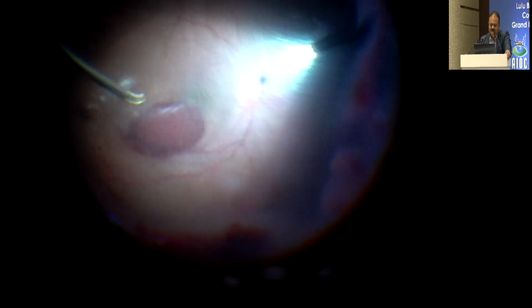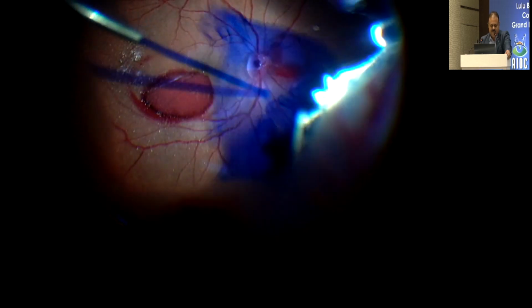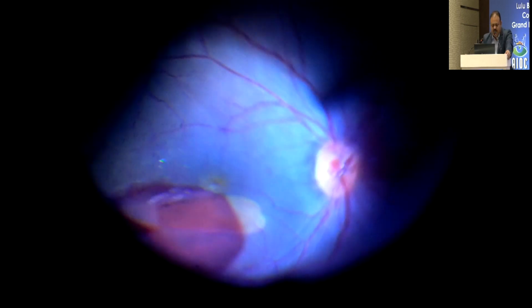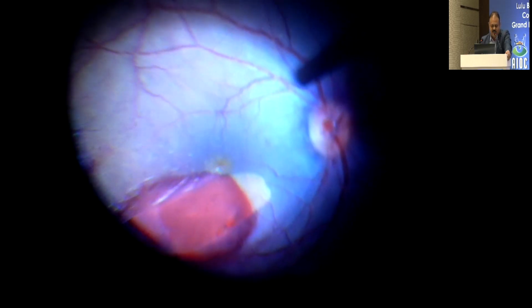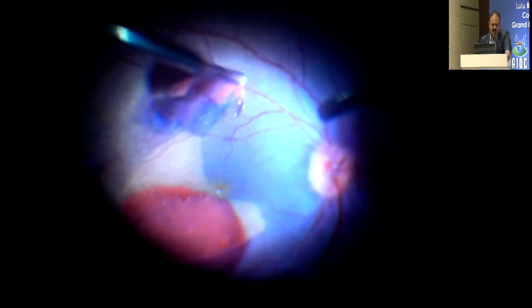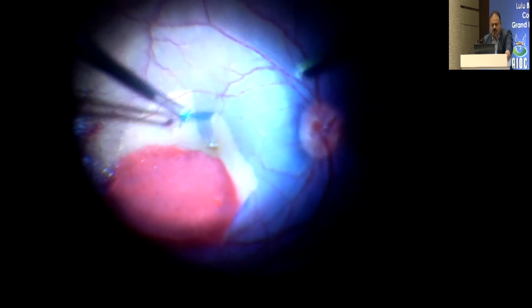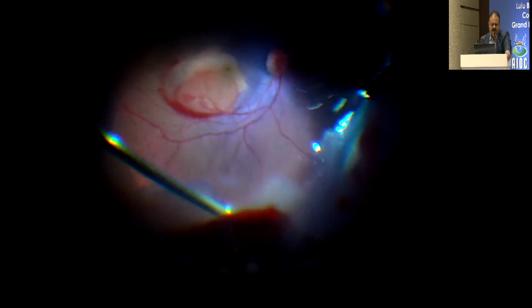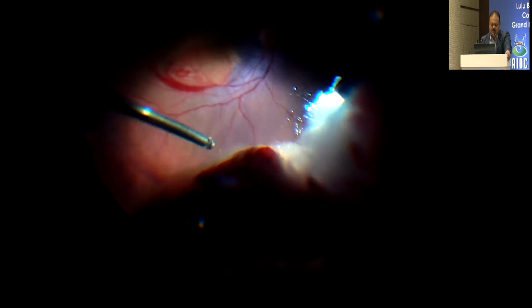Trimming the base, looking for any residual vitreous. Now this patient starts coughing, so I had to explain to her, and in between the cough period I was peeling. The intention was to remove this ILM, clear off the blood, and quickly close, because once we remove this sub-ILM bleeding, our work is almost done. As you can see, after the ILM peeling, the bleeding is dislodging. But there was quite thick blood in the periphery, so I decided to trim it quickly and come out.